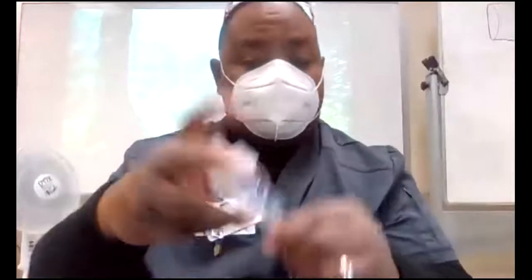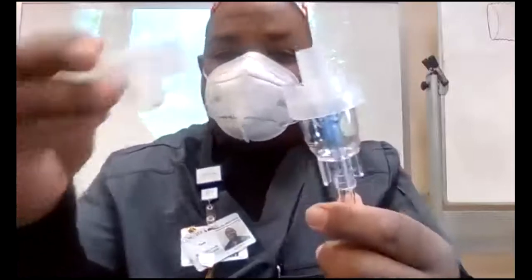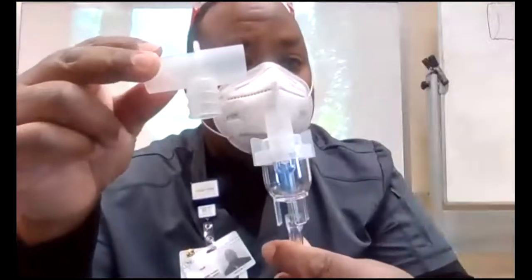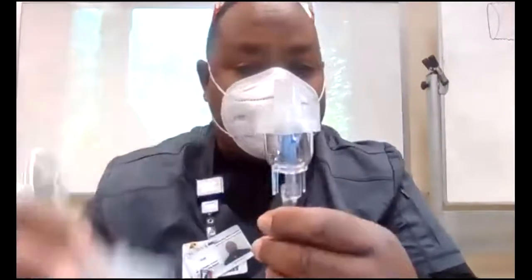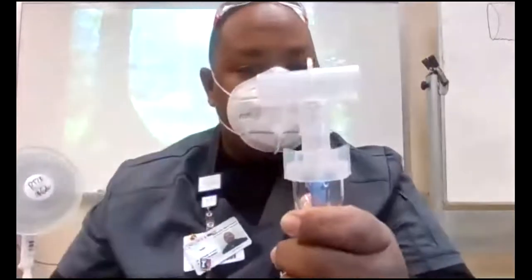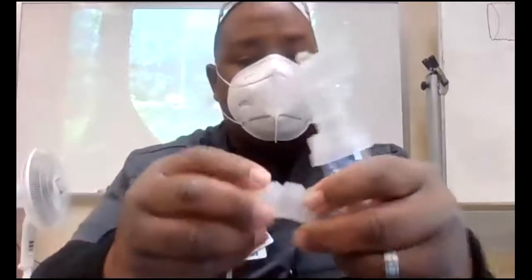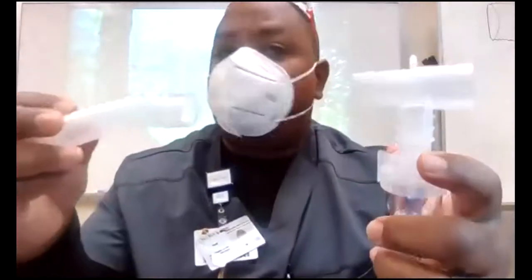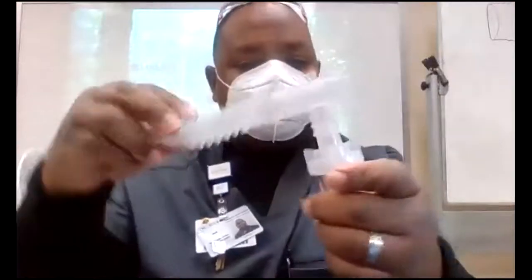Now, you've got your small bore tubing on your medicine cup. Then you have the T-piece, also known as the Briggs adapter. After I put my medicine in there, I put the Briggs adapter on top, like that. Now, what's next? This piece here is called the reservoir tube. It only fits on one end, okay? This is the reservoir tube.